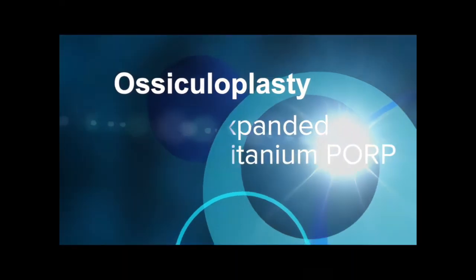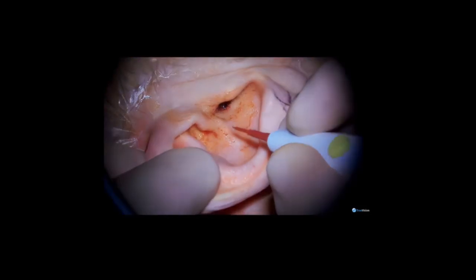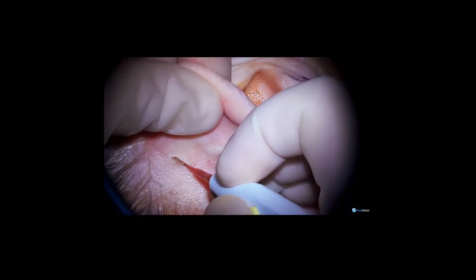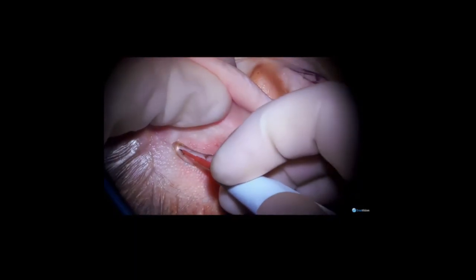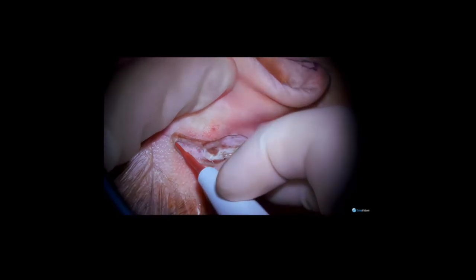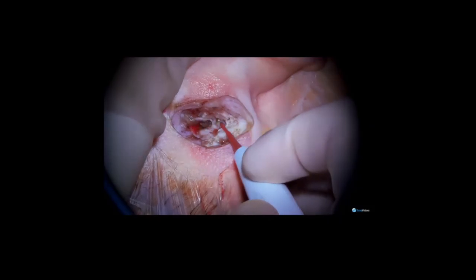The patient in this video had a large cholesteatoma that was removed. The eardrum was reconstructed with thin-cut sheets of cartilage, and I used an intact canal wall procedure. I am looking through an ear speculum. At this point, I'm measuring the location where I need to access the mastoid and get into the middle ear through the posterior tympanotomy so as not to disturb the recreated eardrum, which has healed very nicely and is solid.